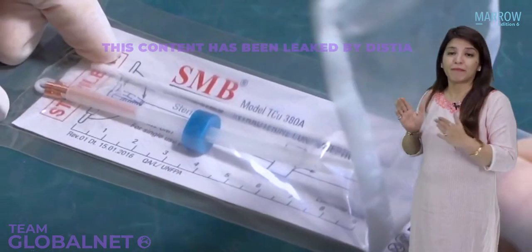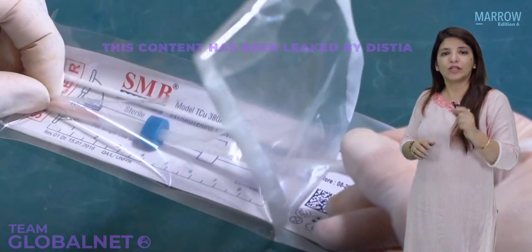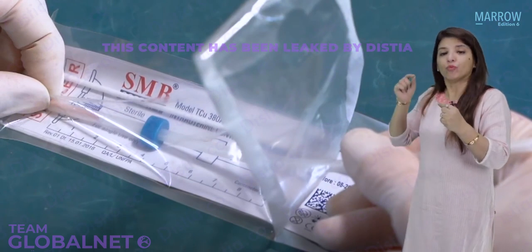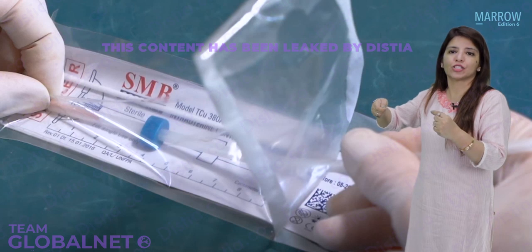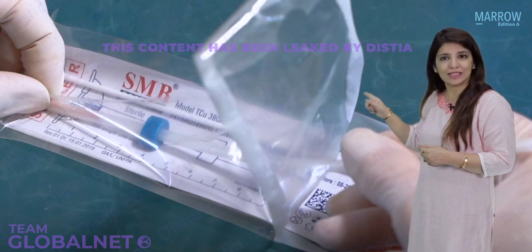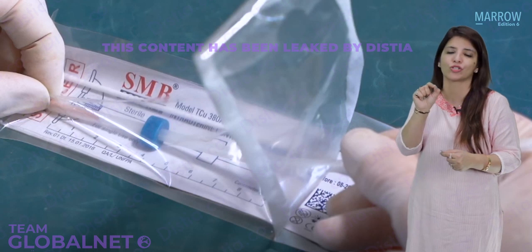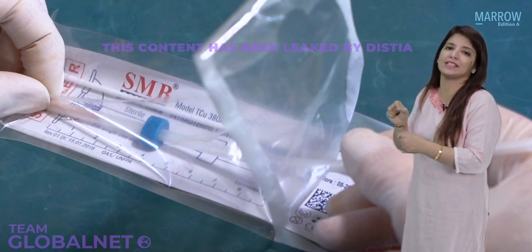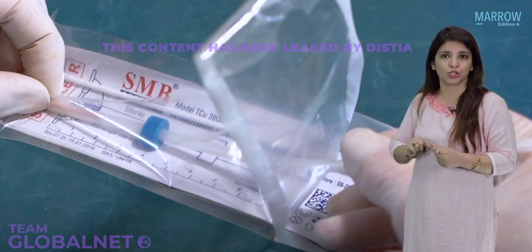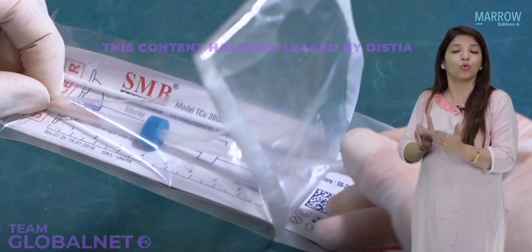Now you're going to open the packet of copper T very carefully. Please do not open the complete package, open it halfway. With your fingers, hold the horizontal arms of the copper T and squeeze them. With the other hand, pull the inserter rod a little back and hold the inserter rod in a pencil-like manner. Once you've held the inserter rod in a pencil-like manner, move it forward again so that both the horizontal arms slip inside the inserter tube. Can you see both the horizontal arms have slipped inside the inserter tube? This is how loading of copper T is done without touching it. This is the no touch technique.